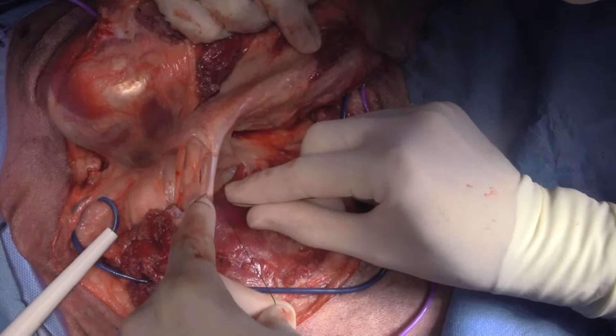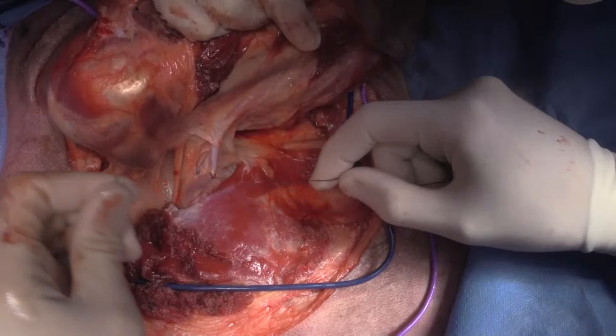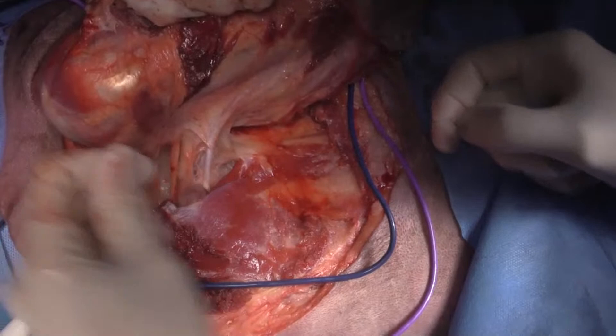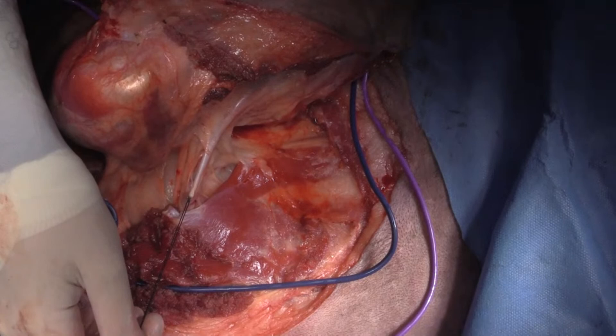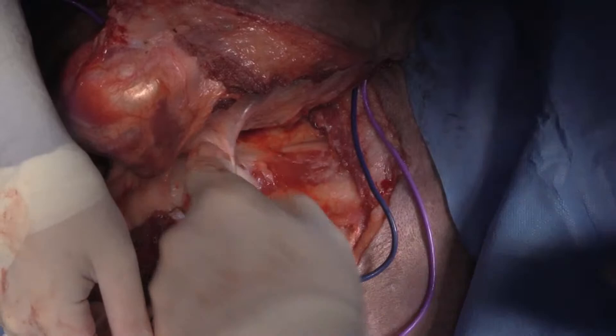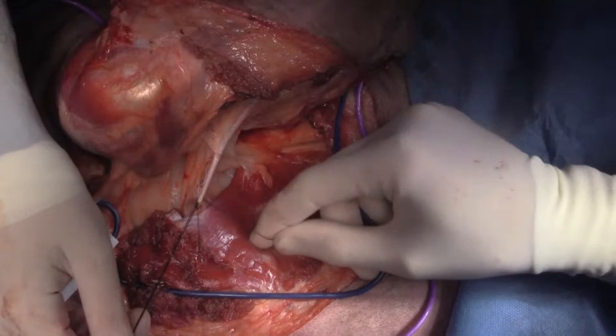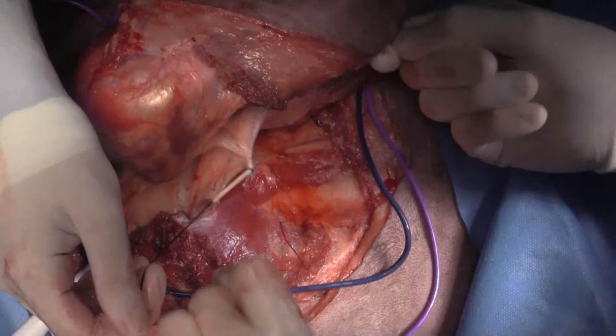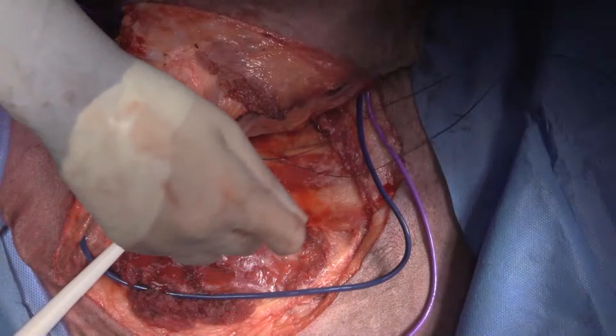I'm just going to do hand ties down here. Can I get some 2-0 PDS please? Wrap around twice and pull it through. Then what I do is I strip the vessel so it's empty of blood — so when I cut it I don't get any blood in my field. It's kind of silly because it's like half a mil of blood, but it looks cool. Then I'm going to do a transfixation ligature.